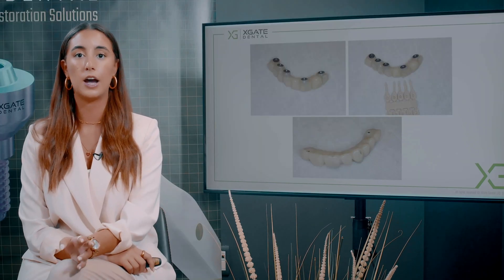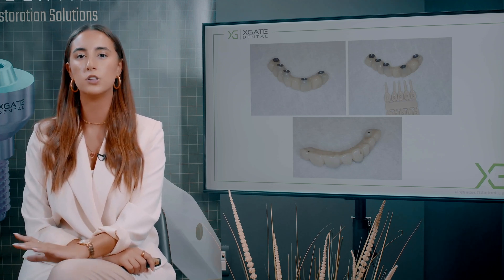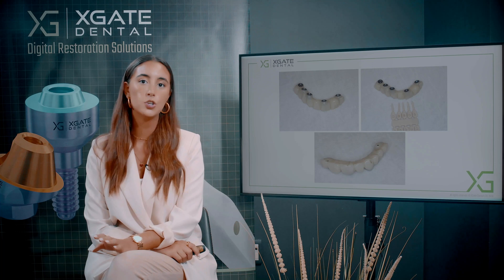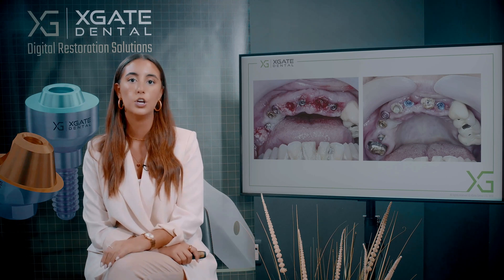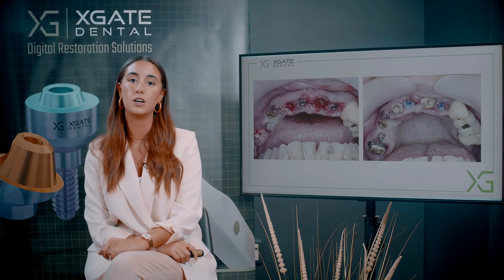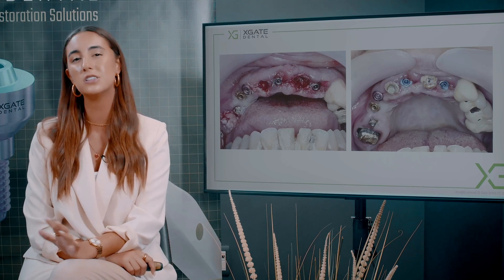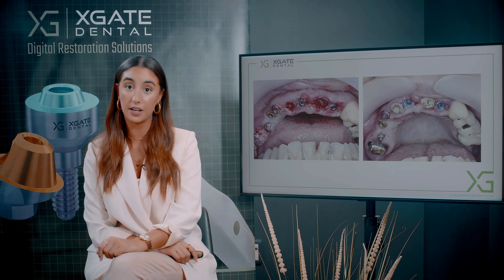The patient waits depending on how long it takes to make the bridge — with a CAD-CAM machine or by sending it to a lab, probably one day to one week. Here you can see the bridge and the screw channels. Some go very buccally. Later on you can switch to angulated multi-units because you didn't have the final bridge design beforehand, so you don't know what type of multi-unit you can use or if you'll have any angulation problem. You can see the extraction sites, the sockets, and the PMMA bridge with the screw holes closed with plastic pins.